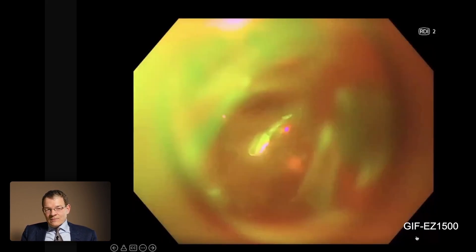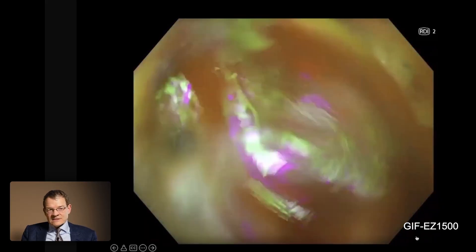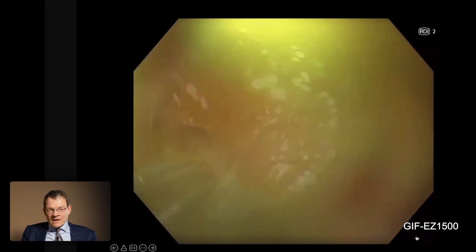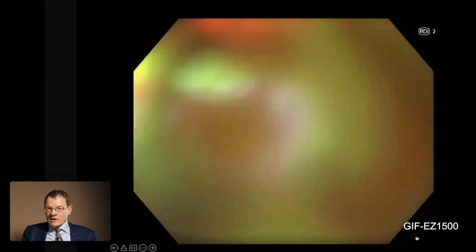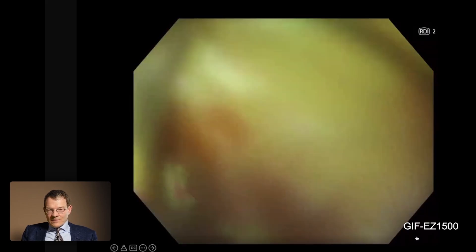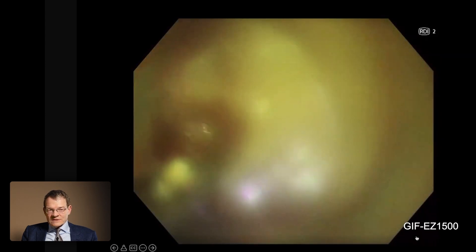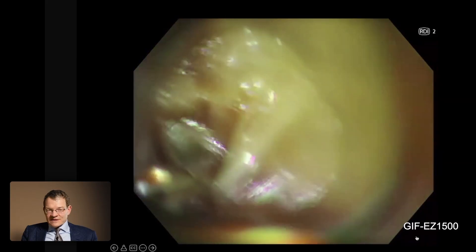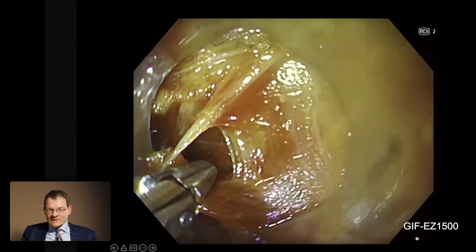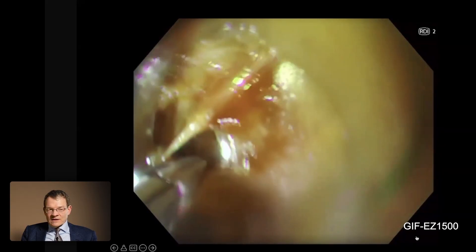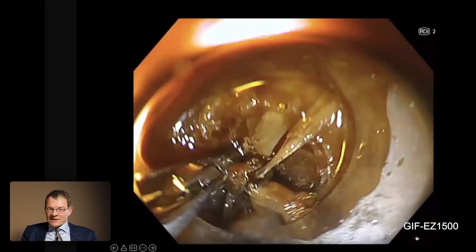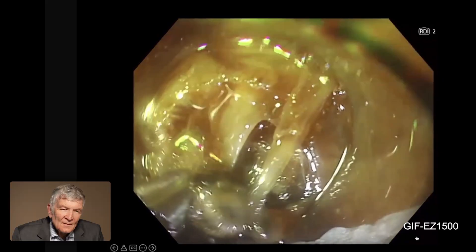By using RDI you have less blood, and even though it is still difficult, we can nicely appreciate the source of the bleeding and now precisely place the coagulation forceps to start coagulating this vessel. In this case it's not done with only one coagulation — there were several arterial vessels — so finally even after the first coagulation there was still bleeding, but you may nicely appreciate that you can control this situation. I have to admit this is definitely a good feature for such critical situations.